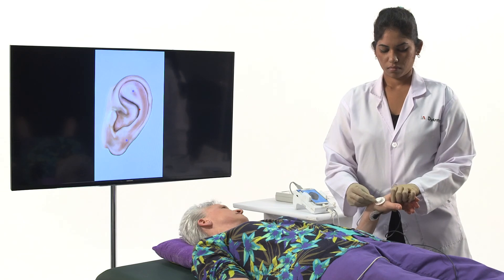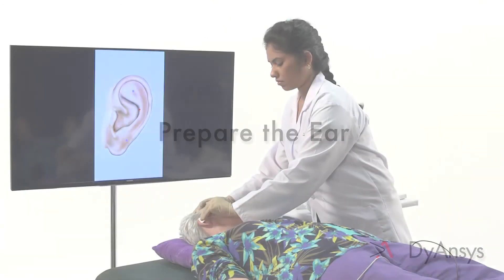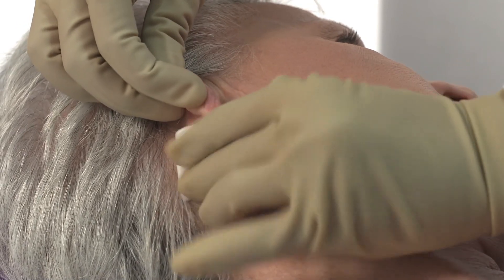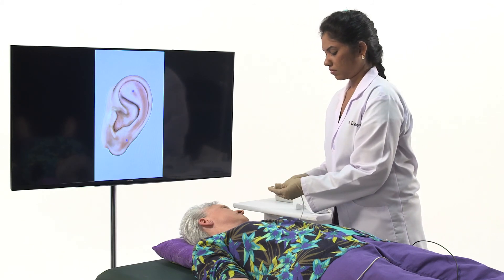For additional points, select Auricular Therapy Guide and choose the specific ear map from the flow chart. Place the ANSYSTEM locator grounding strap on the patient's wrist. Prepare the ear. Thoroughly clean the ear and behind the ear using an alcohol pad. This will remove oils and dirt that may prevent the ANSYSTEM control module from adhering to the skin.